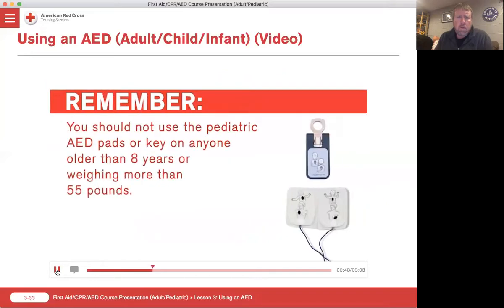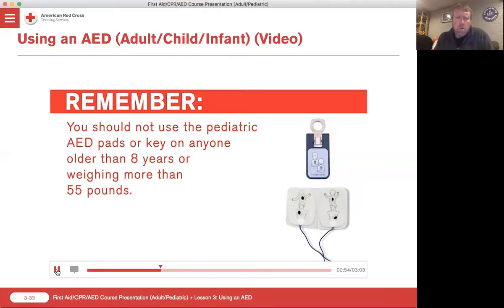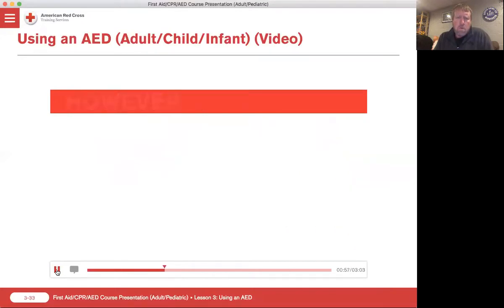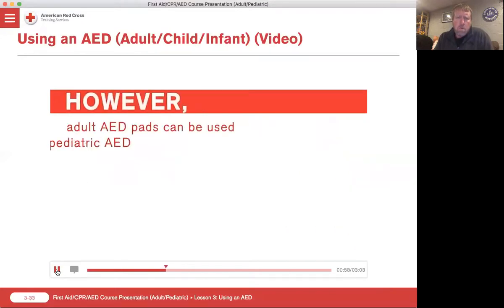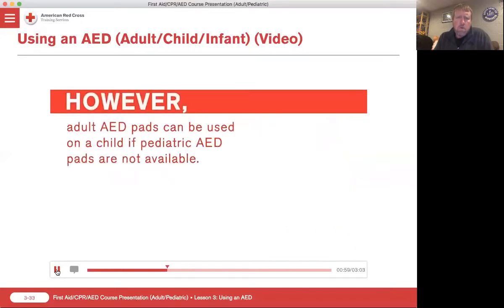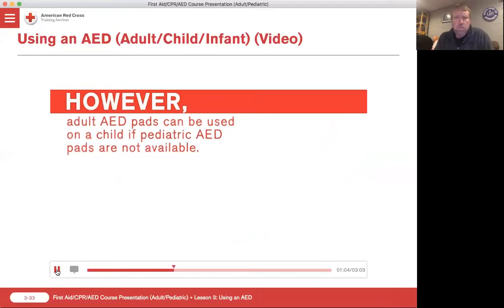Remember, you should not use the pediatric AED pads or key on anyone older than eight years or weighing more than 55 pounds. However, adult AED pads can be used on a child if pediatric AED pads are not available.